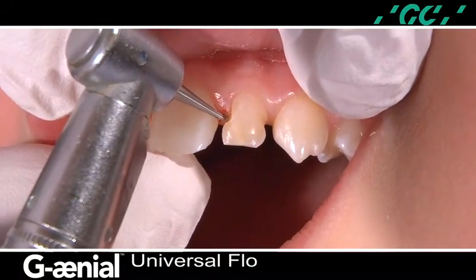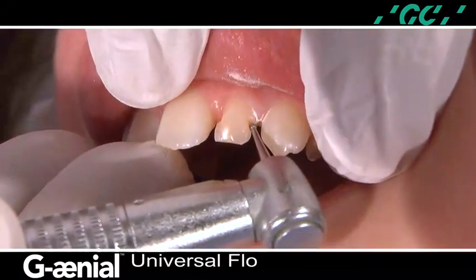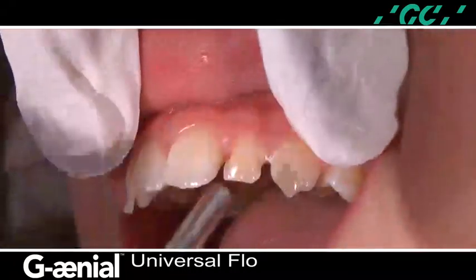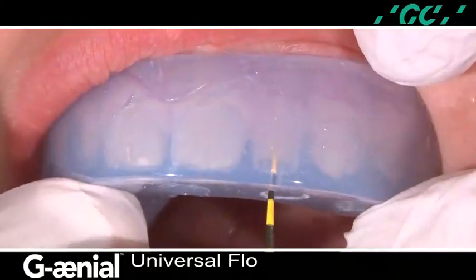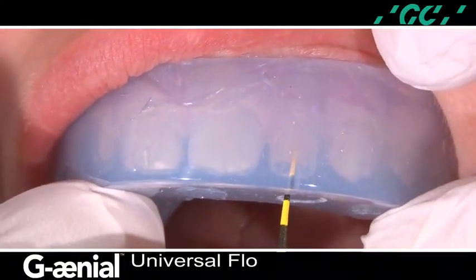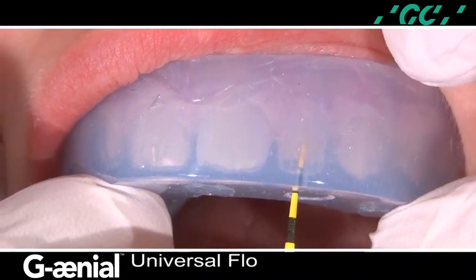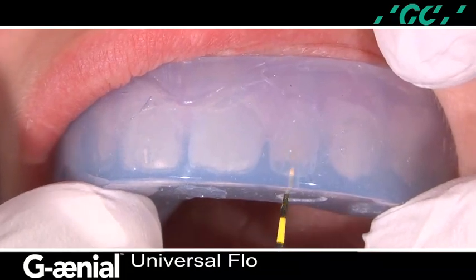The caries is removed with a number 2 high-speed round burr, which produces rounded line angles. This allows for a better resin adaptation since all internal line angles are rounded and the cavity walls are made smooth. After the adhesive procedure is completed, the clear silicone matrix is again placed over the maxillary arch and inspected for proper adaptation, seal, and for a proper path of insertion for the flowable material.